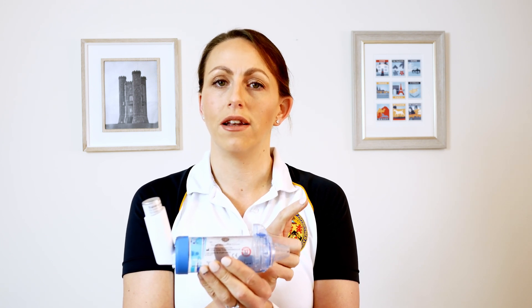Remember that this inhaler fires the drug very fast, and you only need to slowly inhale that drug as deep down as you can into your lungs. The research has shown there's no difference between one inhalation with up to a 10-second hold, or two to three quiet inhalations if you're unable to hold your breath — so it's whatever really works for the patient: two to three breaths in and out.